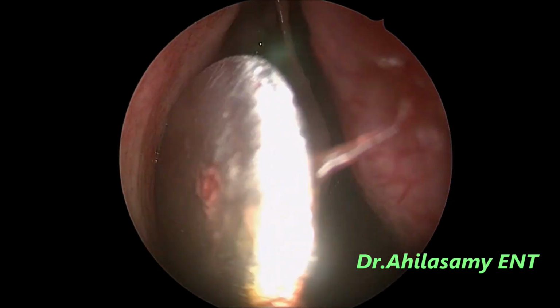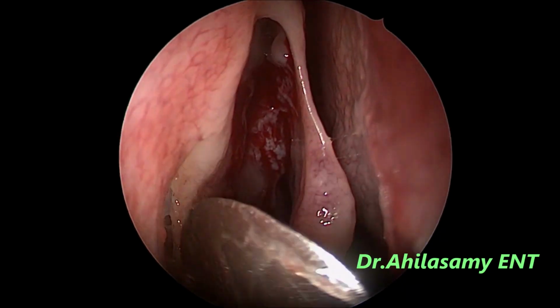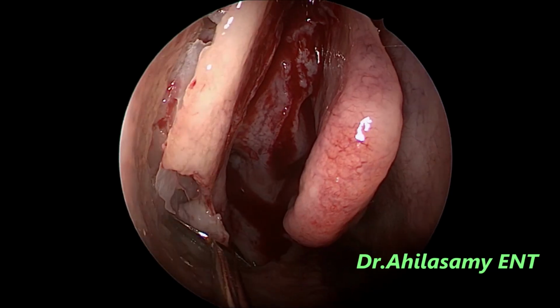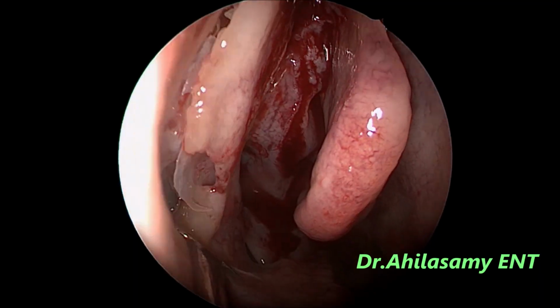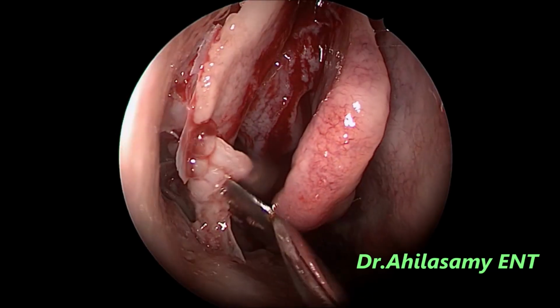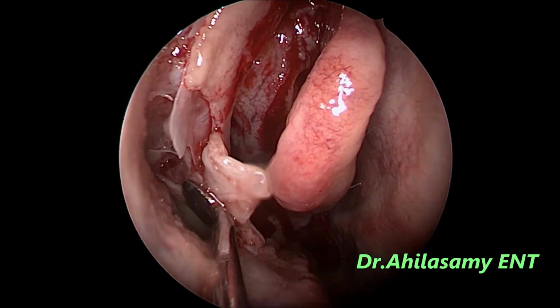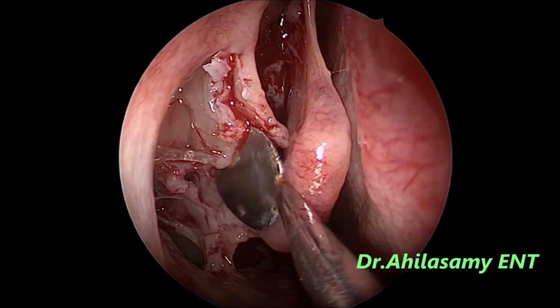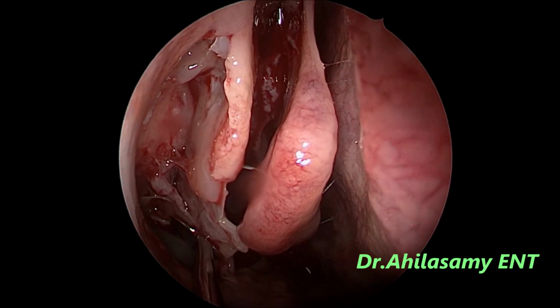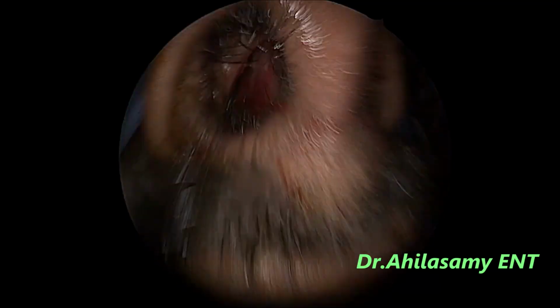Now we have got a good normal anatomy. Again, now I am using Dr. Ahilas, my innovation, the snare dissector. In one stroke, you will dissect the uncinate and you go into the maxillary sinus. That's the beauty of this instrument. You can see the maxillary sinus, you can see the uncinate very clearly dissected. Appreciate the quality of the field under local anesthesia again. Hardly any bleeding.